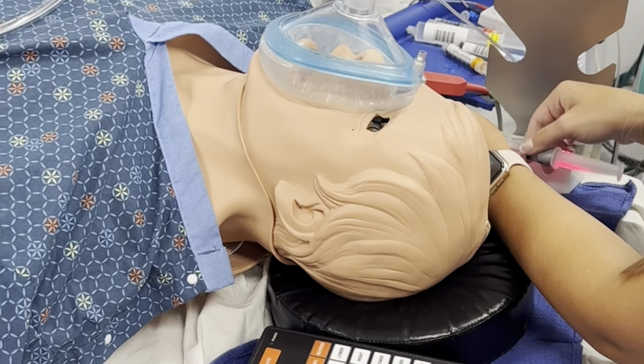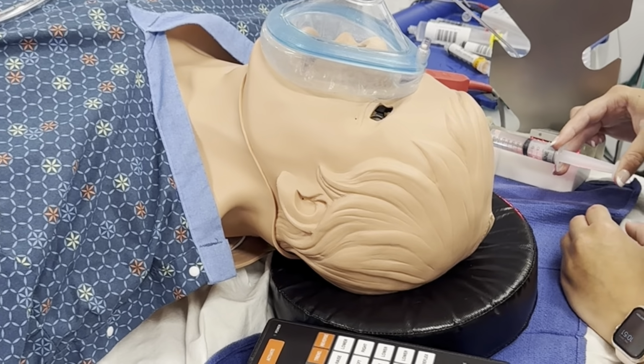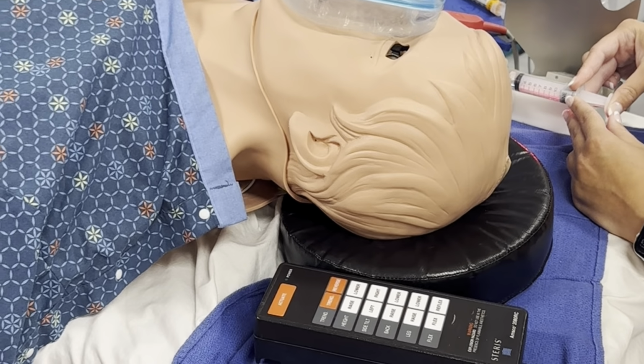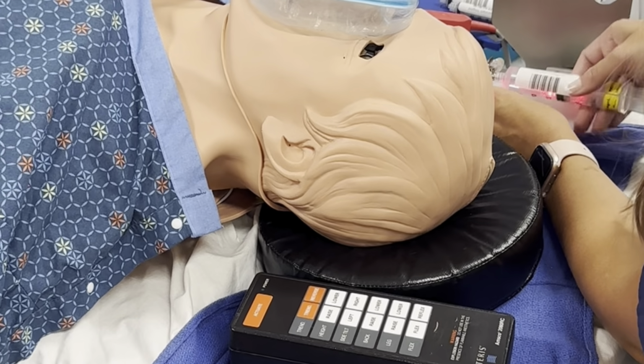The propofol, which is our main induction agent that we're going to use for this patient, stings really bad through the IV when you give it. So we give the lidocaine to kind of blunt that pain stimulus. I'm gonna give our main induction agent, which is propofol, and that'll help the patient go off to sleep.